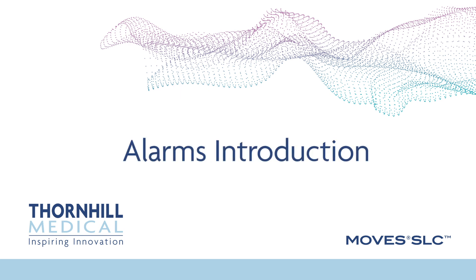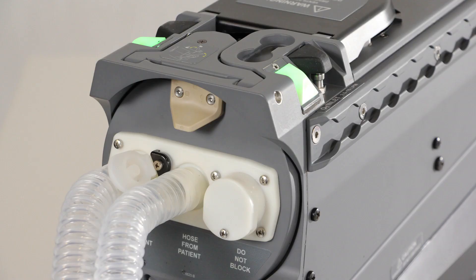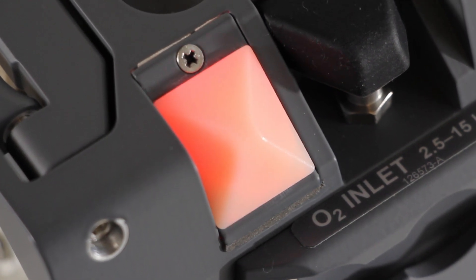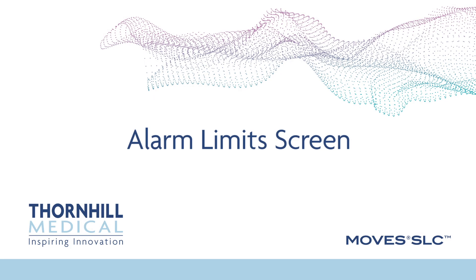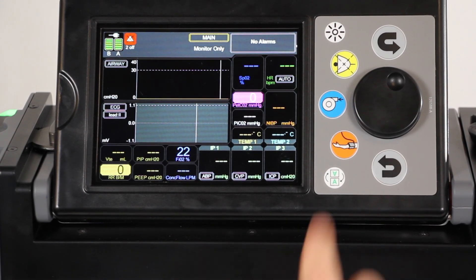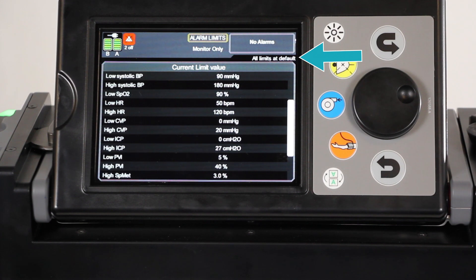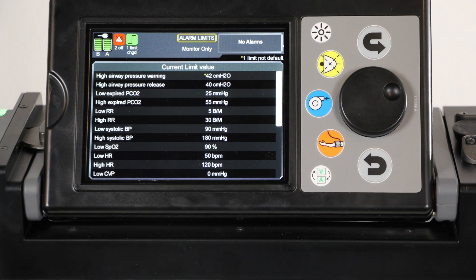Alarms. The MOVES SLC has four status LEDs situated in each top corner of the device. When the system is not in alarm, the status LEDs are solid green. When the system is in alarm, the status LEDs are solid yellow, flashing yellow, or flashing red in order of priority from low to medium to high. The alarm limits screen allows you to control the alarm limit values. Navigate to the alarm limits screen from the screen select button. If no limits have been changed from their default values, the phrase 'all limits at default' is shown. If any limits have been changed, an icon and a summary of the number of limits not at their default values is displayed, and the limit value is displayed with an asterisk.